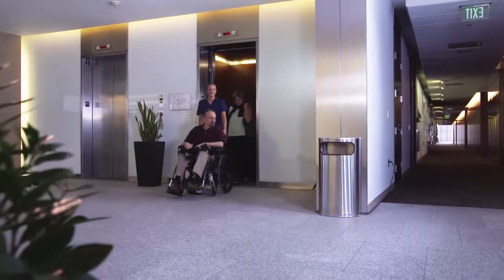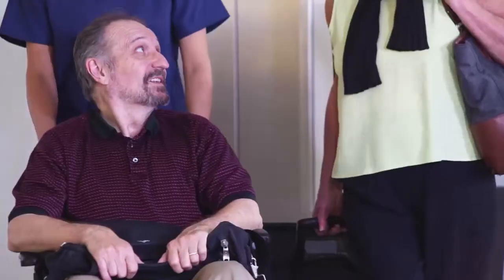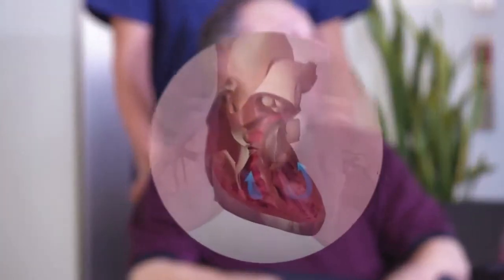What if there was a tool that would alert your doctor that your heart failure may be getting worse even before you felt symptoms? Today, for heart failure patients like you, there is.